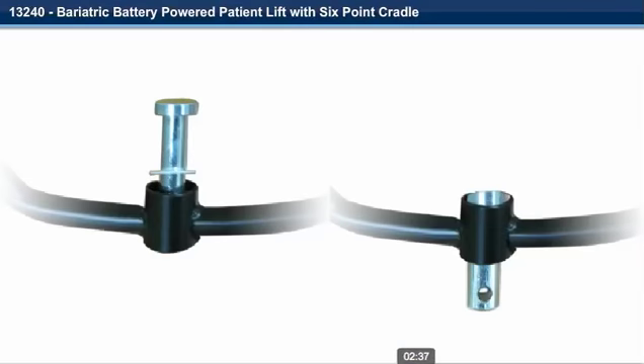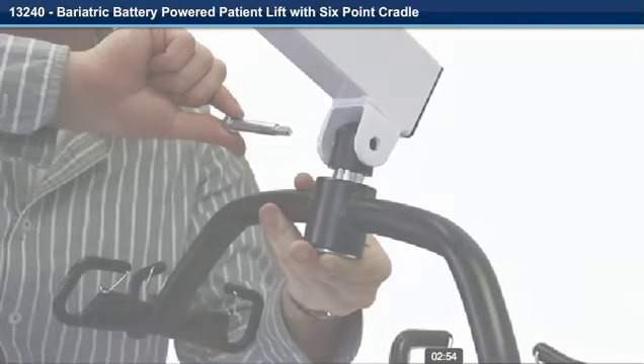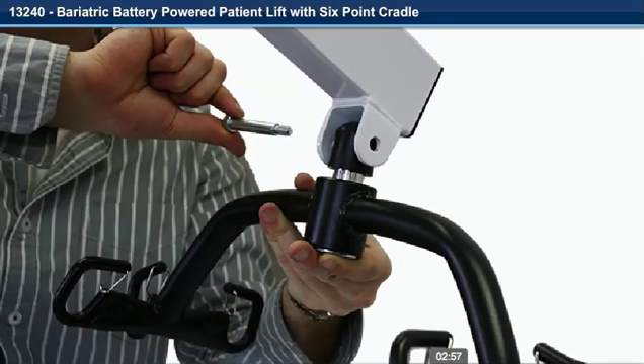Step 16. Insert the cradle swivel pin and nylon washer into the cradle. Step 17. Install the nylon cover over the cradle swivel pin and line up the holes of both. Step 18. Align the holes of the cradle pin and cap with the holes in the U-bracket at the end of the boom.